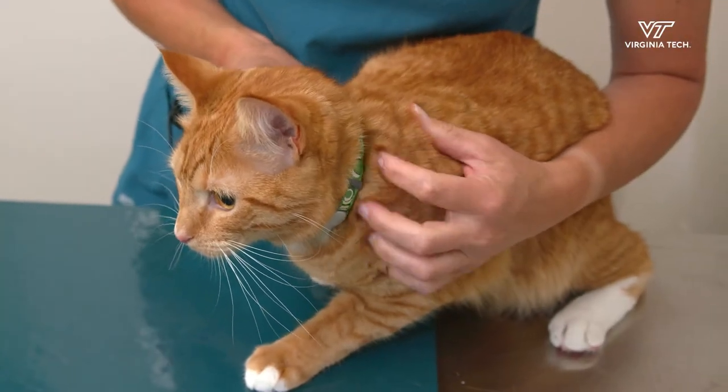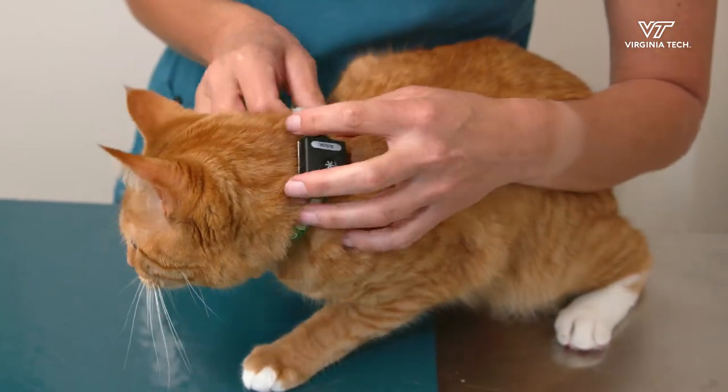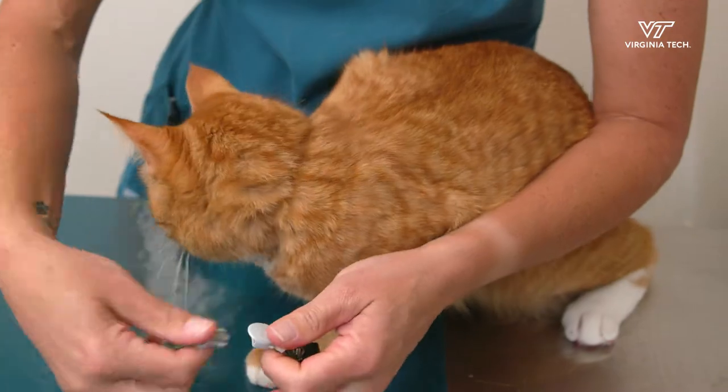The first week wearing the monitor will be the adjustment period. You can gradually increase the time your cat wears the collar with the monitor each day. By the end of the week the collar needs to remain on at all times with the exception of the PEMF treatments.